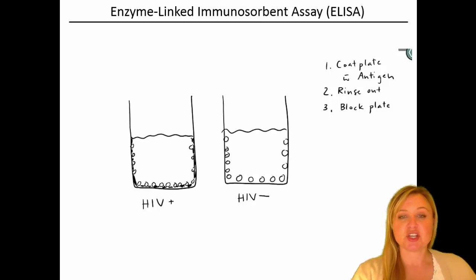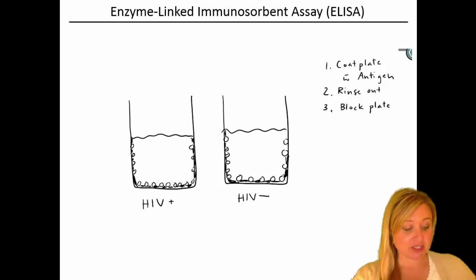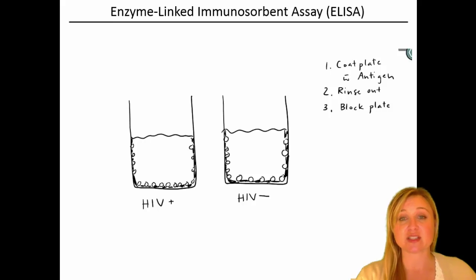So the ability to create ELISAs like this is one of the amazing applications of an ELISA. We could look for antibodies against nearly any antigen. As long as we have some of that antigen, we can just coat it on the ELISA plate and it will stick to the plate. Okay, so we have ELISAs against hundreds of different proteins, different antibodies, and we use them a lot, both in clinical research laboratories, but we can also use this in research as well.